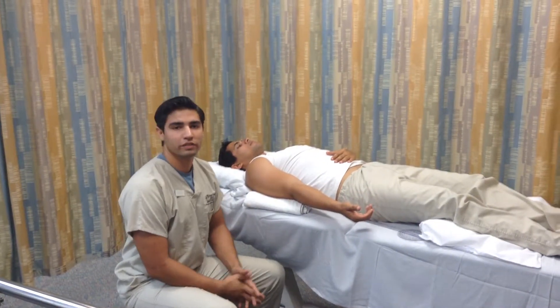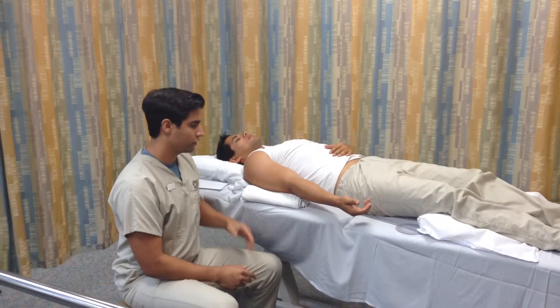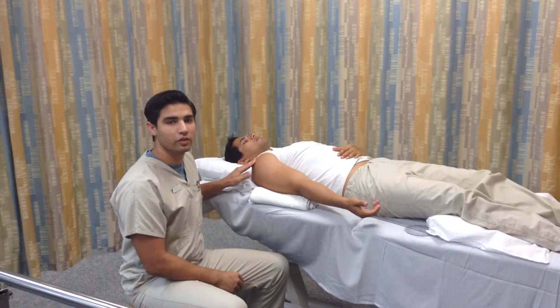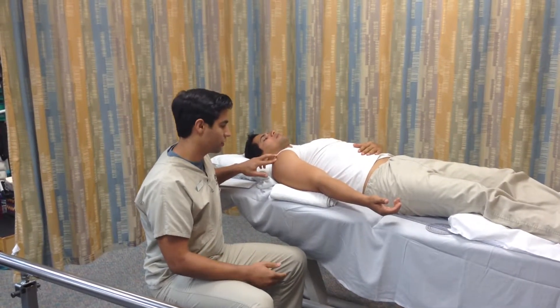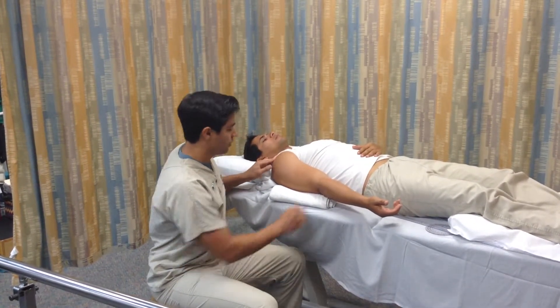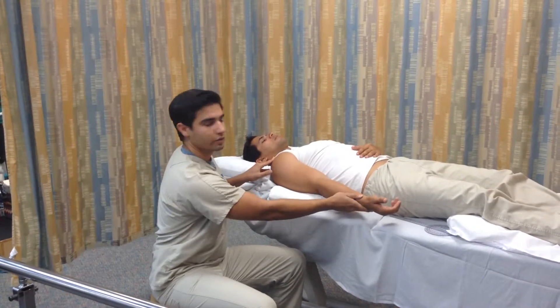We're going to be measuring the range of motion for right elbow flexion. To begin, we need to know a few things as far as landmarks go: the lateral aspect of the acromion or the center of the acromion process, the lateral epicondyle of the humerus, and the styloid process of the radius.